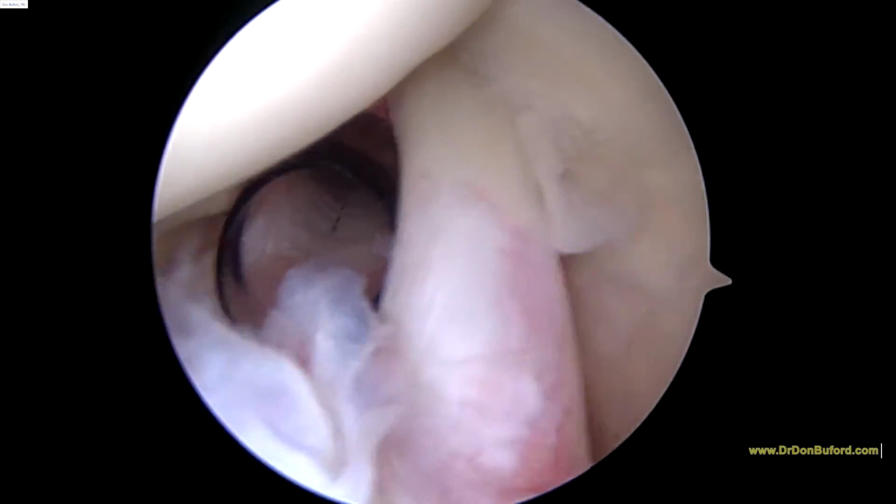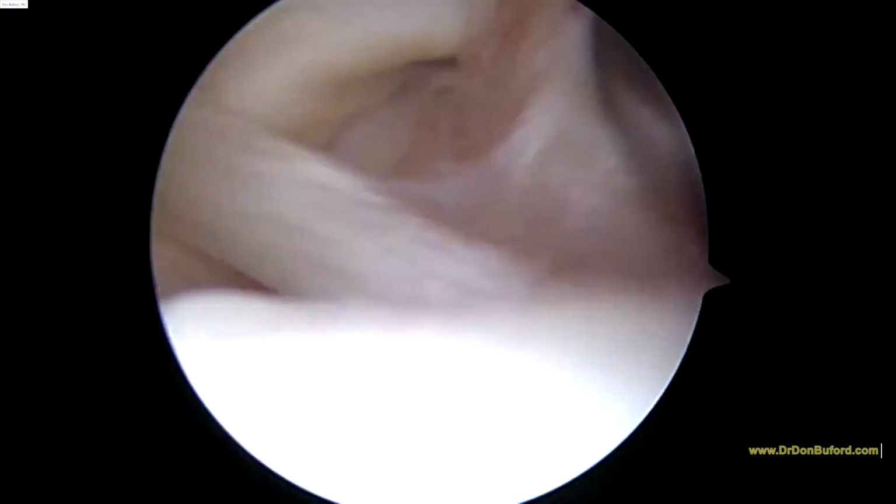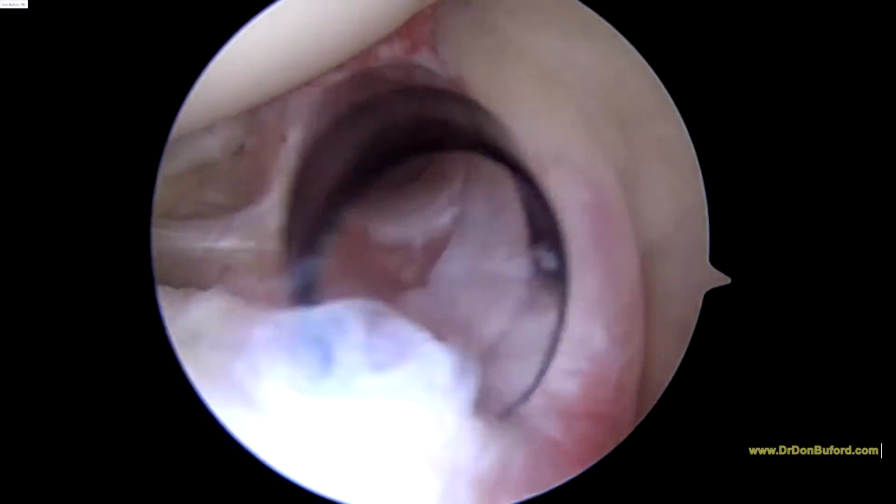I'm Dr. Buford. I'm here with Dr. Moore. We're just getting started on your left shoulder. We're looking at from the back to the front. Everything that you see is magnified about 40 times on the screen.